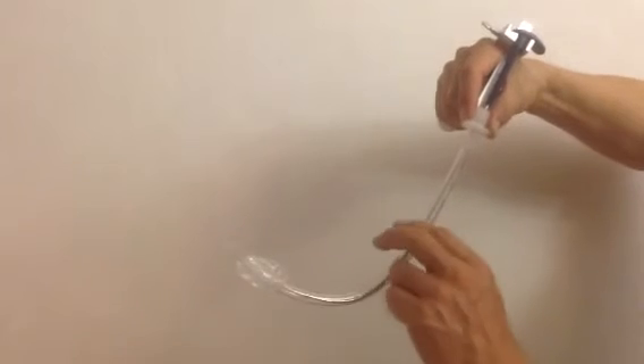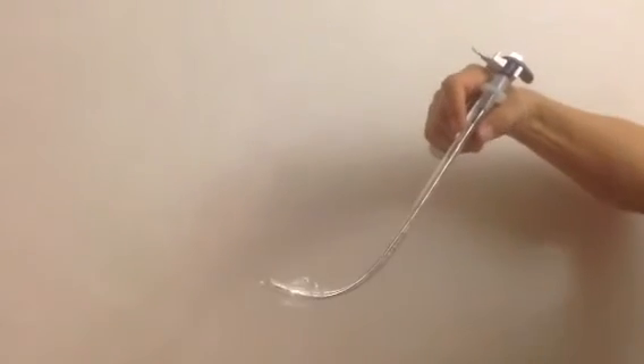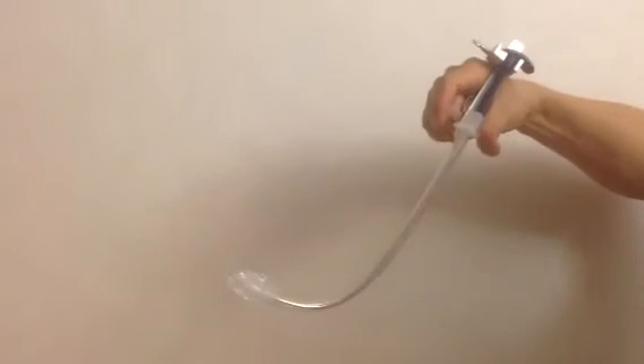So this one will go straight to the vocal cord and the trachea. Push — good. Intubate. That's it. It's pretty good.